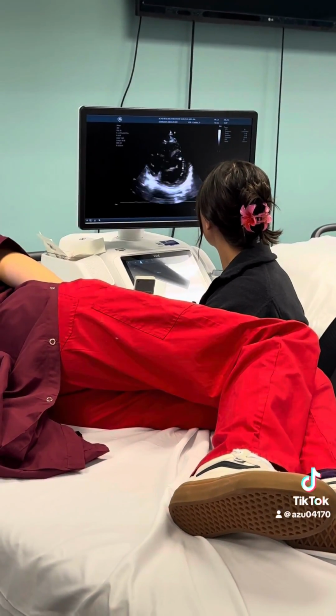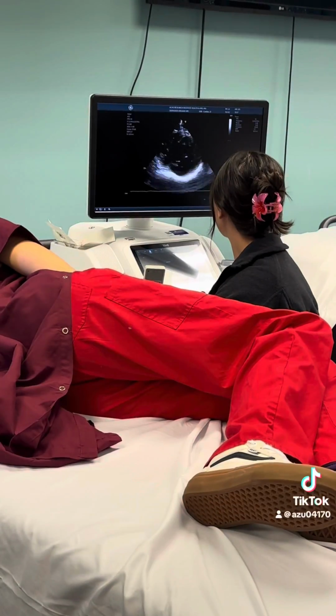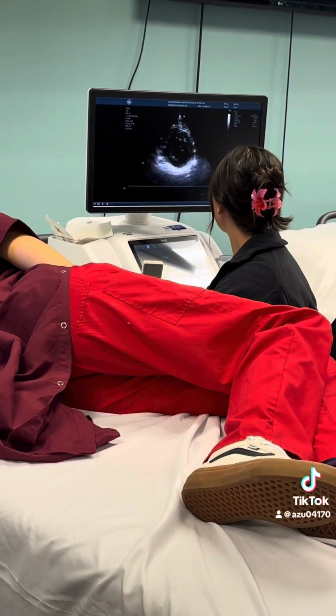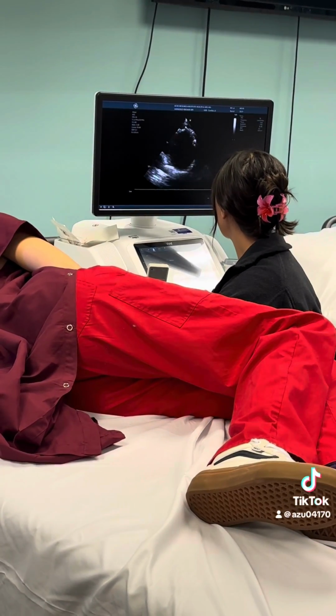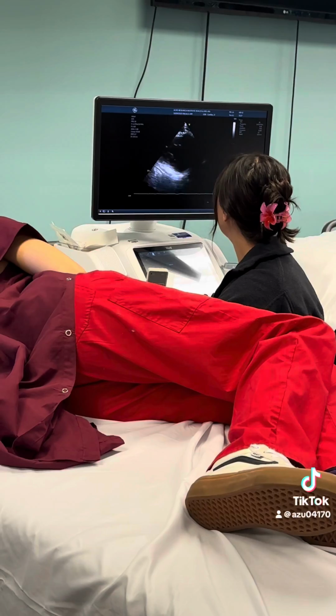Continue tilting the probe inferiorly towards the patient's feet. For this view, you will see the papillary muscle view. You'll be able to see the right ventricle, the left ventricle. The papillary muscles come into view.